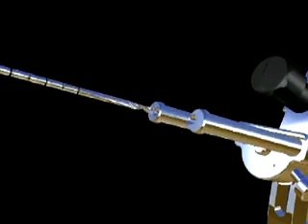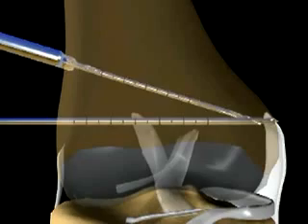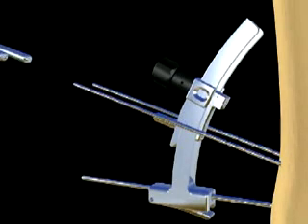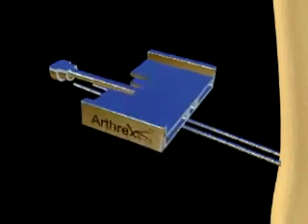The osteotomy guide pins are drilled parallel to the joint surface until they intersect the transverse pin 1 cm from the medial cortex. The guide is removed, followed by the transverse pin. The osteotomy cutting guide is placed over the guide pins.